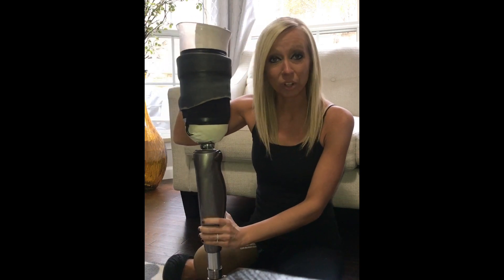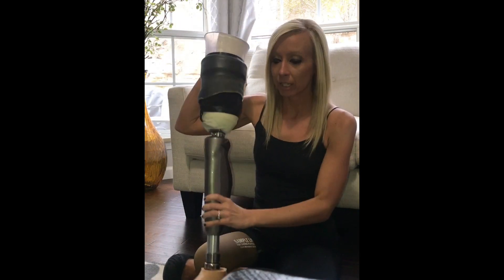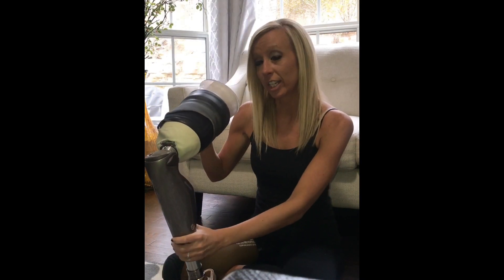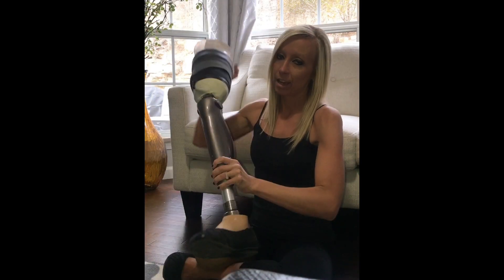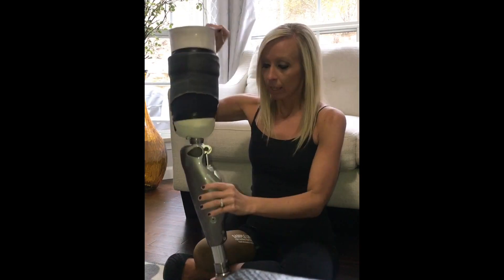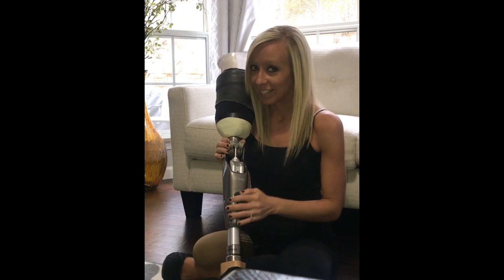It's really cool — it responds based off pressure. Like going downstairs, I ride it down, put pressure on it, and it just kicks back so I can take my next step. A lot of people have also had questions about charging it — yes, I do have to charge it.